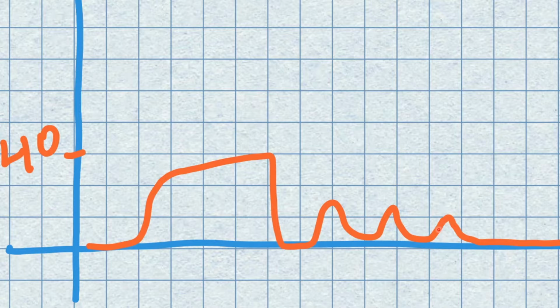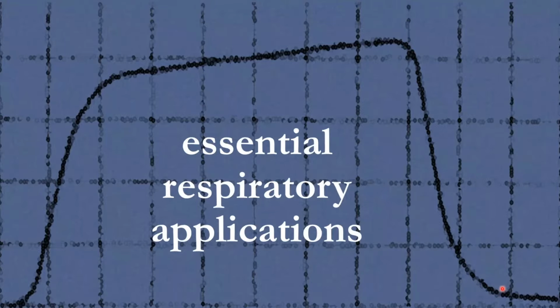Now, I can't tell you whether they're obstructing their airway or whether they're truly hypoventilating from the sedation, but once you start to see this and then it goes flat, you need to start being worried. Or actually, you need to be worried right about here and just keep a close eye on that patient. Sometimes it's simple, they just need a jaw thrust or a chin lift, but sometimes you need to go to an advanced airway.